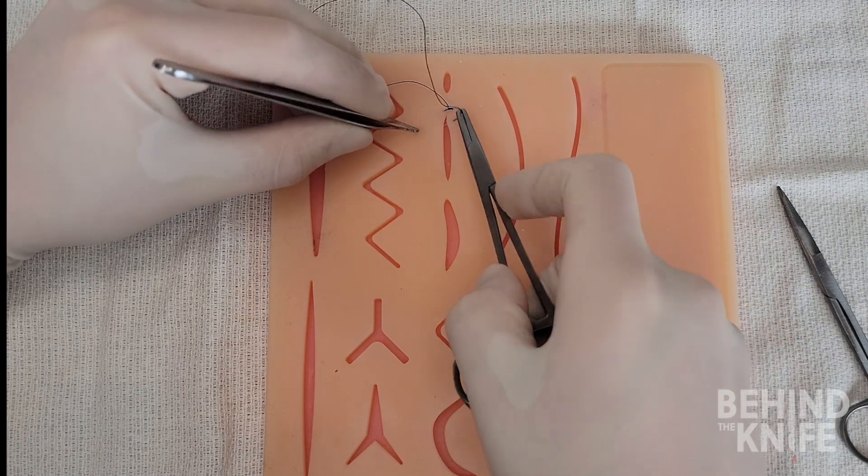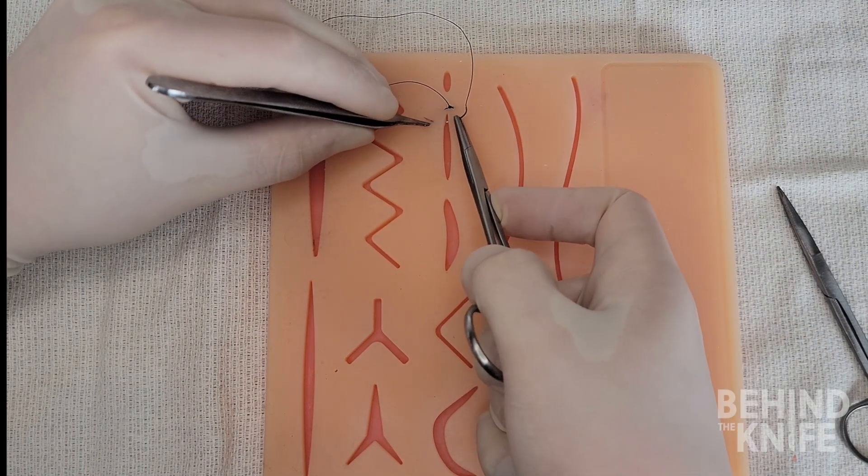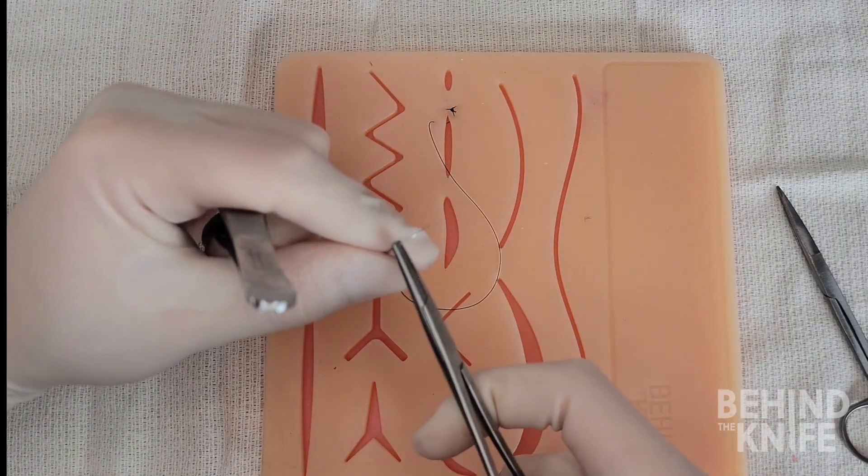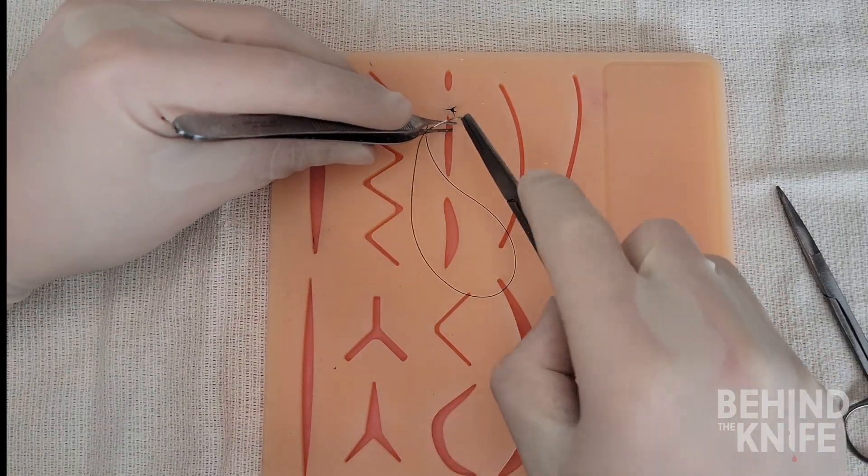We will then throw a series of simple interrupted throws moving towards us but instead of tying a knot we will just reload our needle when it comes out of the epidermis in preparation for the next sequential throw.